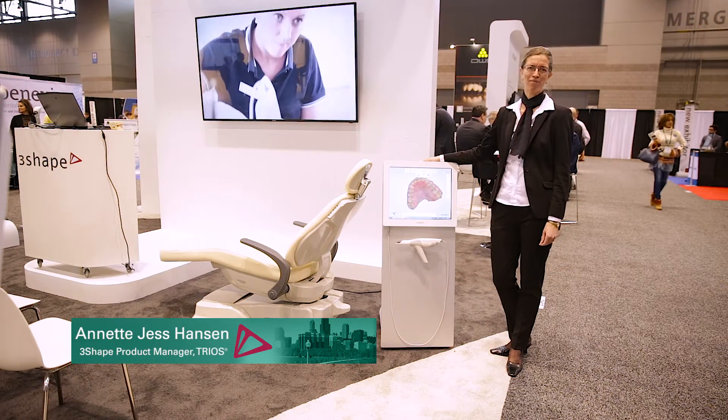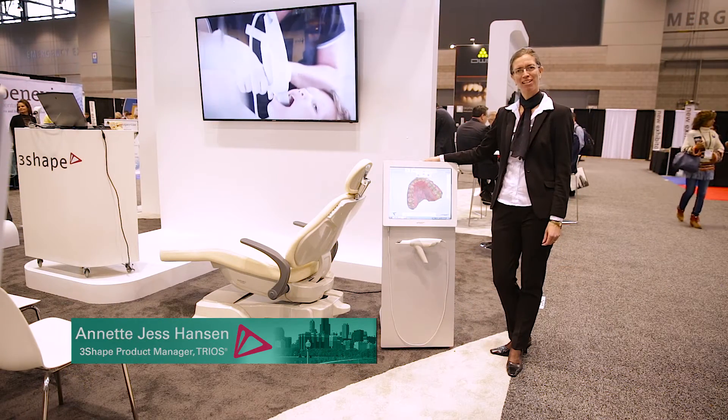Hi, my name is Elena Jess Hansen. I'm the product manager of Trios. Welcome to Chicago to the trade show.